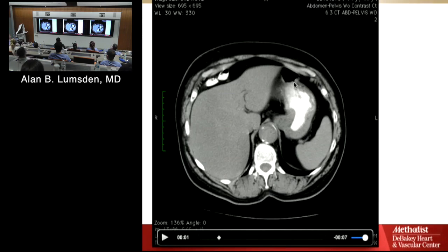And remember we talked about yesterday, to expose the aorta here, you got to take down the left lobe of the liver. You're coming straight down here to get exposure. So there's a left triangular ligament up above it. You got to take it down. Sometimes these things are really thin and floppy and easy to move. Sometimes they're kind of fat like it is here, and it's difficult to fold it. Typically, you take it and fold it back and hold it back with a retractor. You got to be careful you don't make a hematoma inside the liver, though.